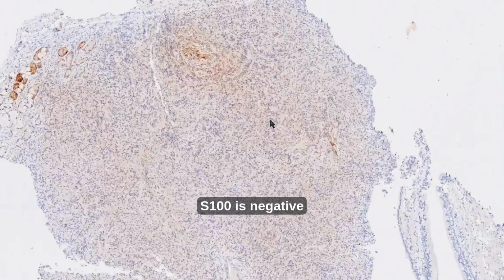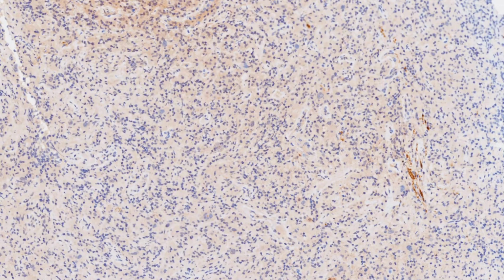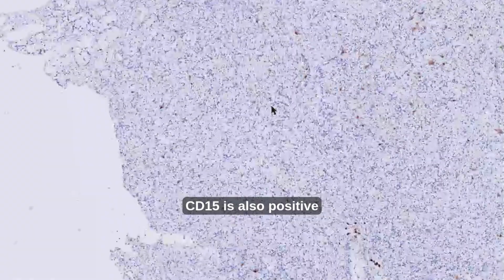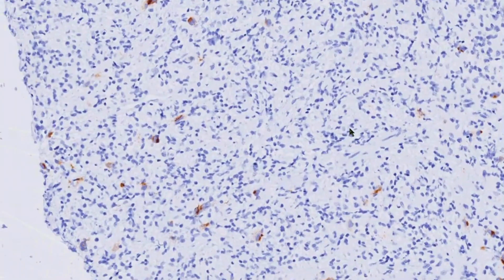S100 is negative with a little bit of background, but negative. CD15 is also positive in the neoplastic cells, as you can see here.